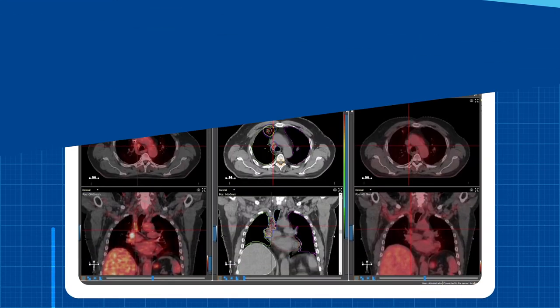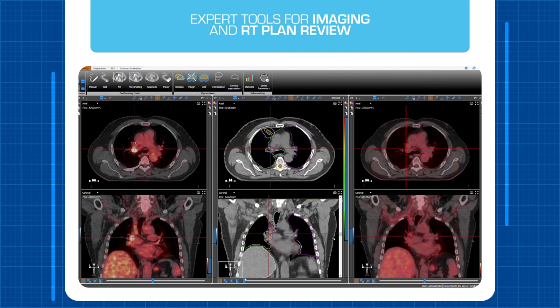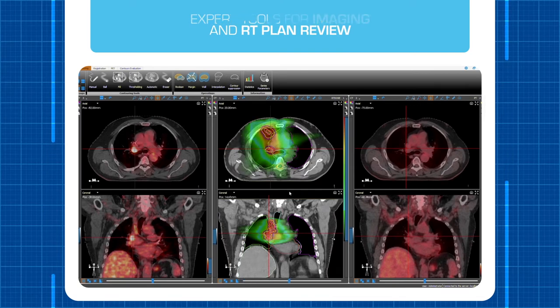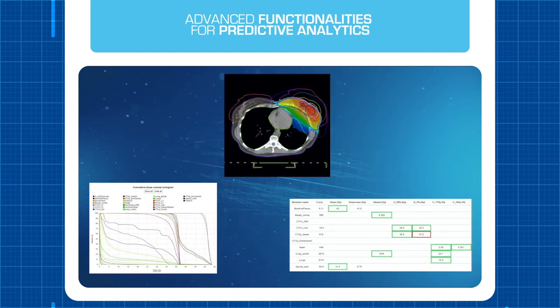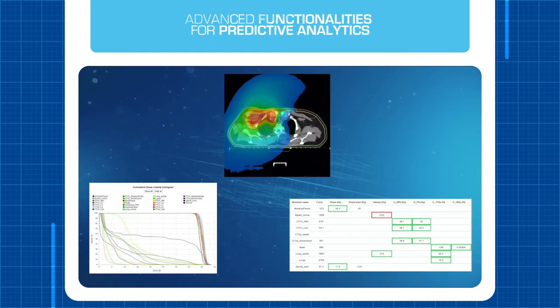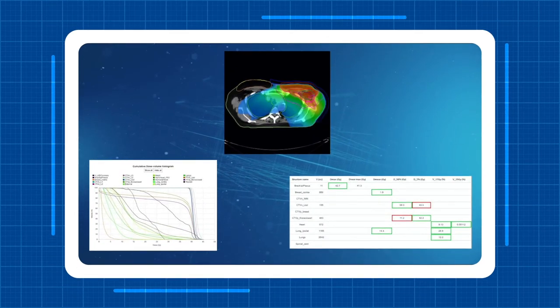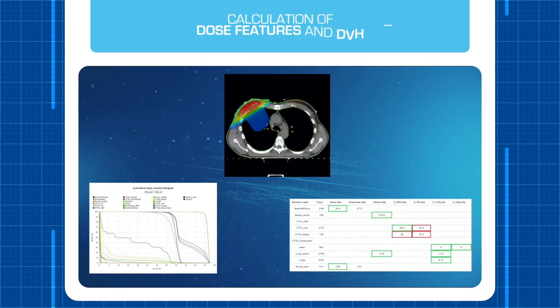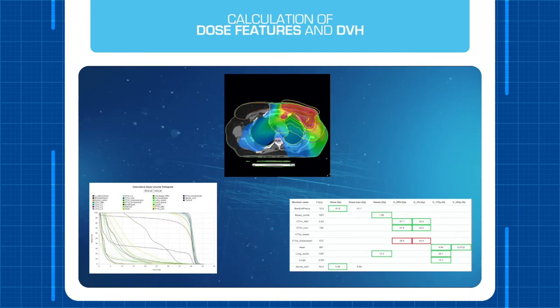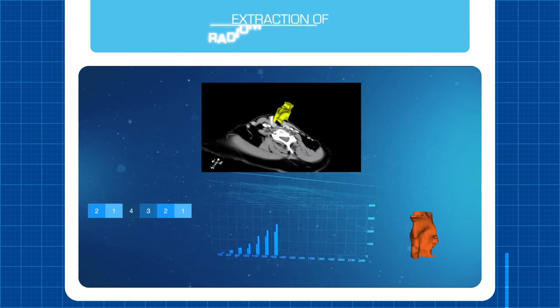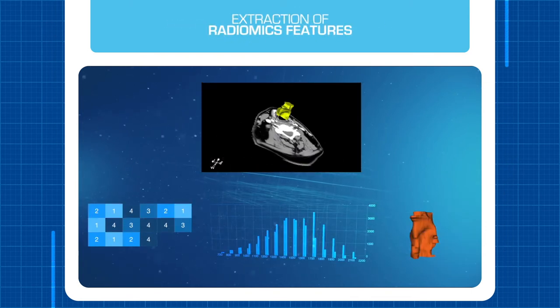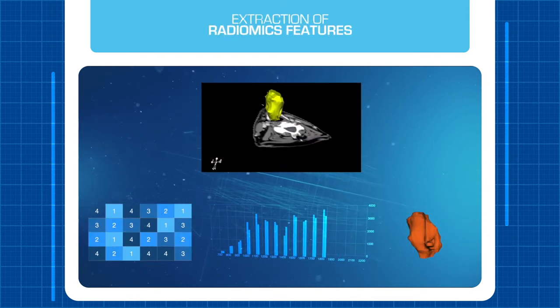It provides advanced tools for imaging review and RT Plan QA based on our RTView software. Use the advanced functionalities of OncoPlace on your collected data to get predictive analysis. Based on DICOM RT data, dose features are calculated for all patients in just one click. Using DICOM images, radiomics features can be extracted on all images.